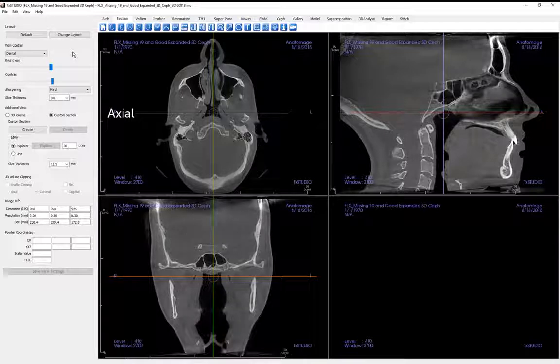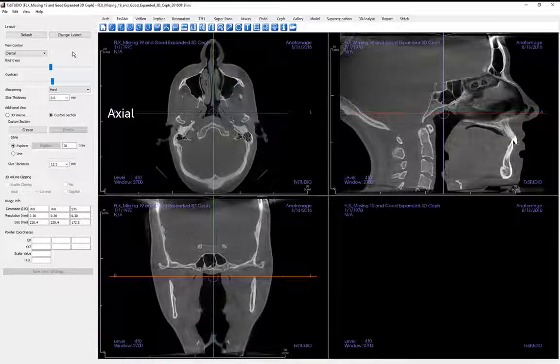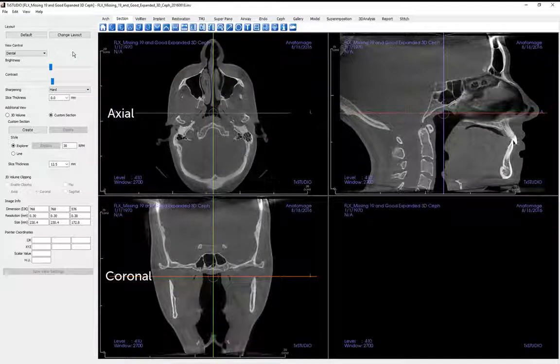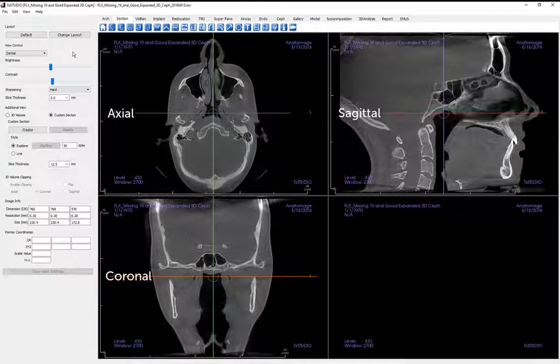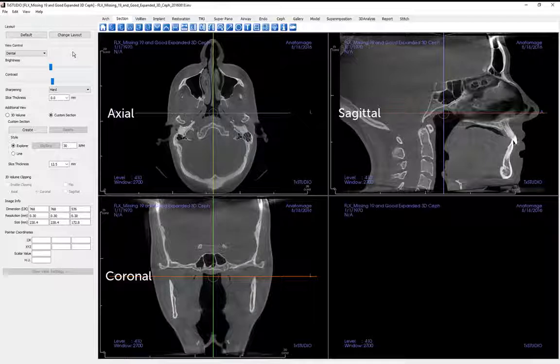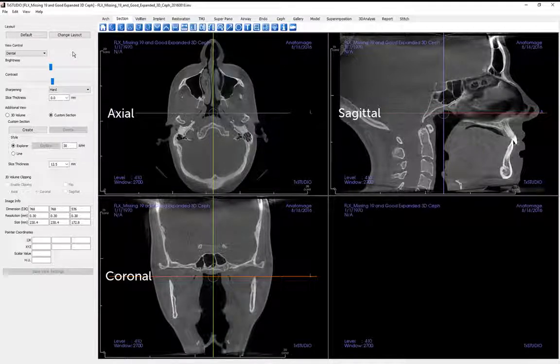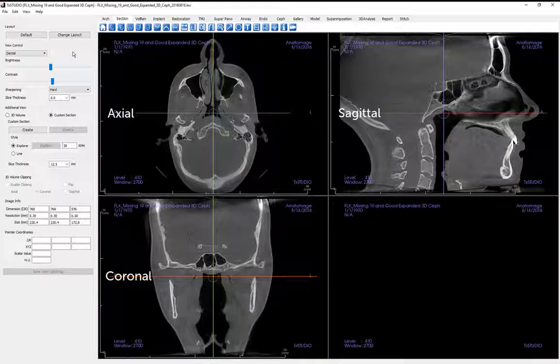In the window just below the axial view, we see the patient's coronal view with slices stacked anterior to posterior. In the window to the top right is the sagittal or lateral view of the patient with slices stacked vertically right to left.